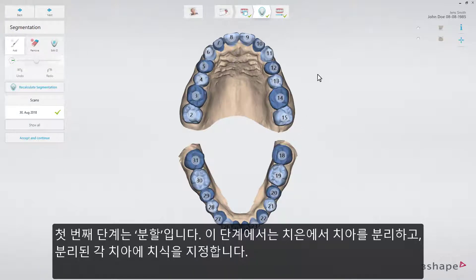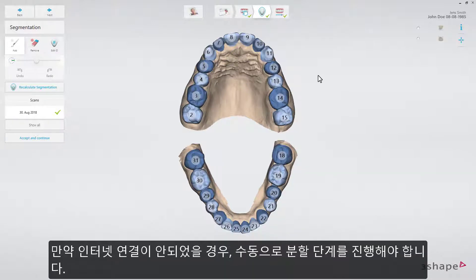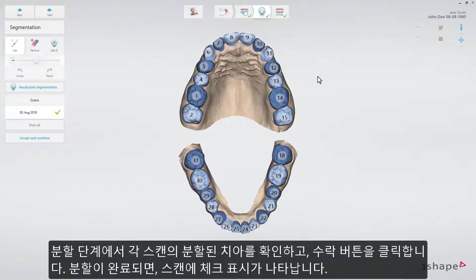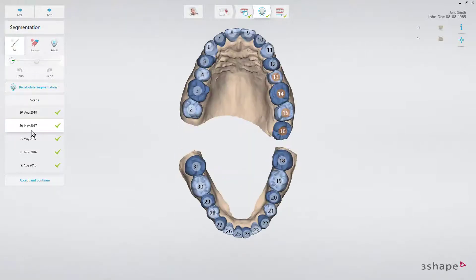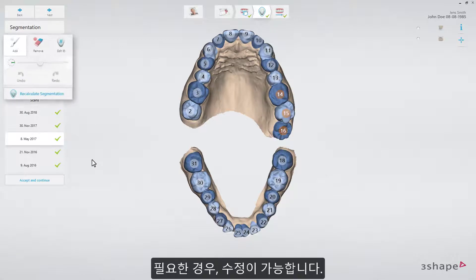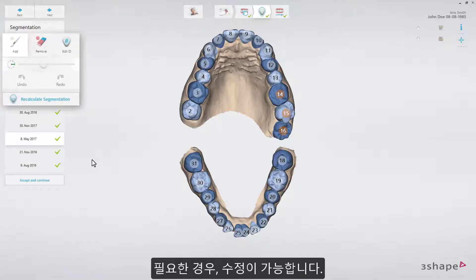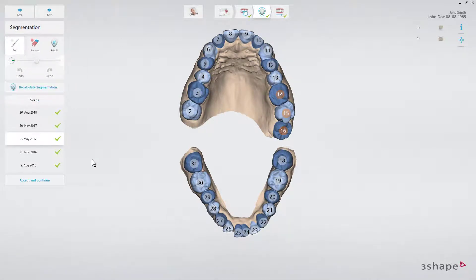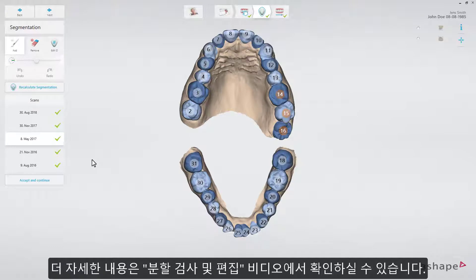The first step you will encounter is segmentation. This step separates the teeth from the gingiva and labels each tooth. If you are offline, segmentation needs to be performed manually. In segmentation, you are required to inspect and accept the segmentation of each scan. Corrections or modifications can be done if needed. To learn more, go to the segmentation video.